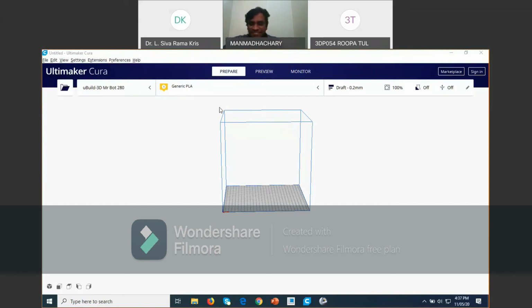Question is, for every medical implant, we cannot reduce infill, right? That depends on your medical implant requirement. As Professor M.V. Reddy Garu told yesterday, in medical you cannot compromise. It's not like engineering design, because it is fixed. Natural bone is solid, so how can I put it hollow? The body won't accept it. Depending on the requirement, the doctor will tell, and accordingly you will do the infill and produce it. It may take more time.